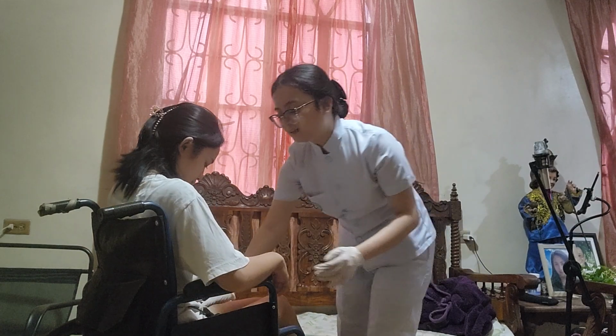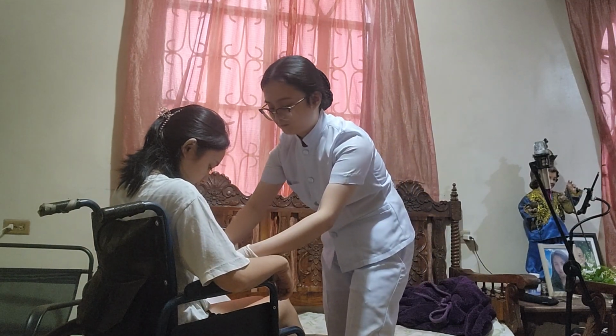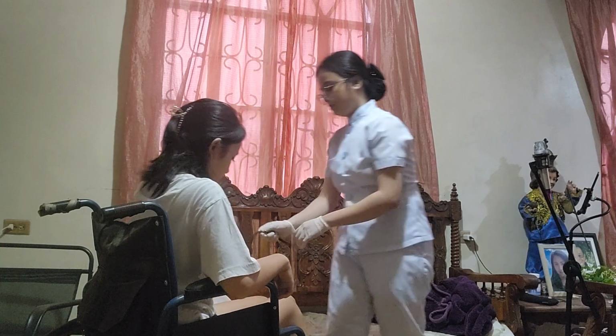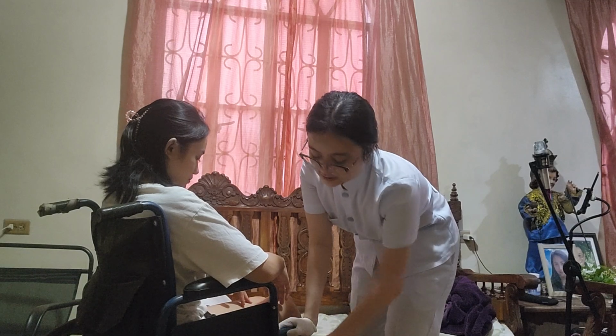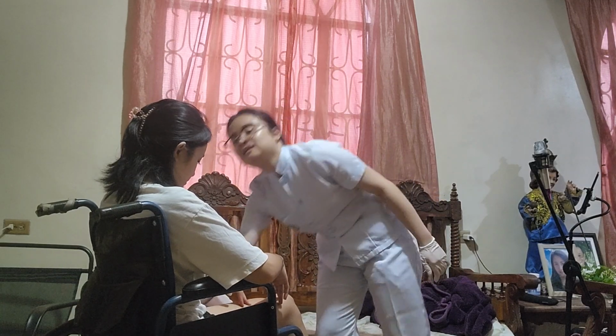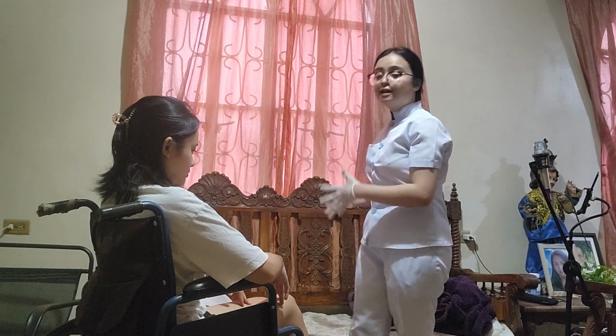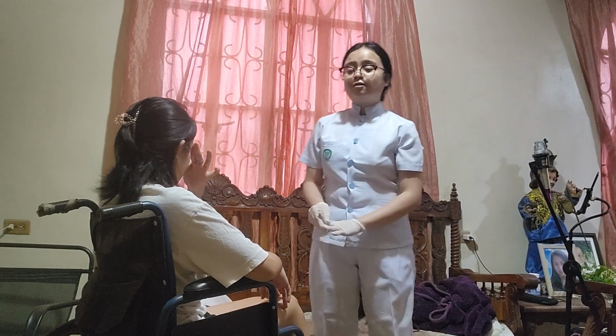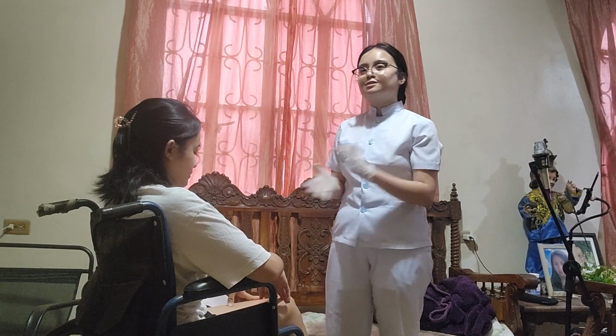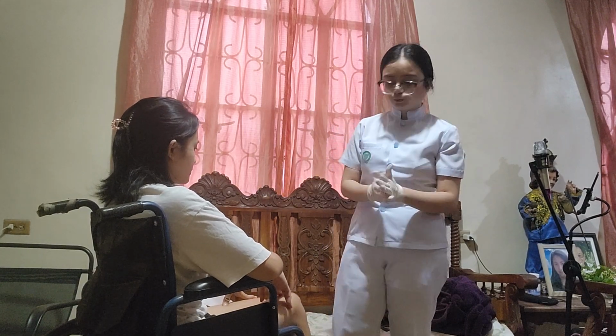And then remove the gait belt and release the brakes. Then it's finished. That's how you transfer the patient from the bed to the wheelchair. Now the patient can go, and I can assist the patient to go to the X-ray room.